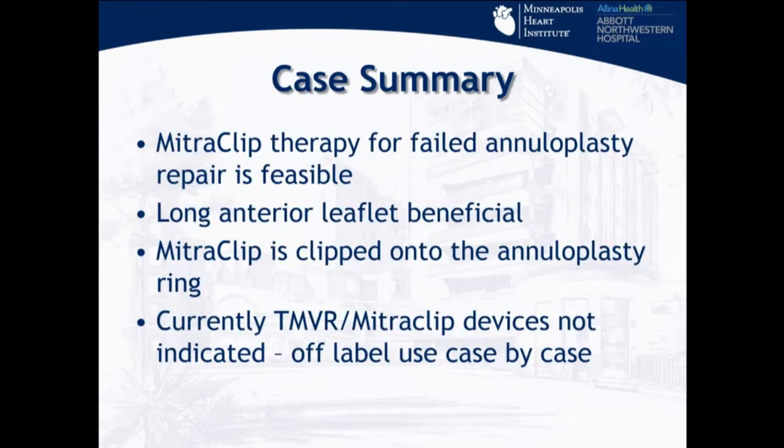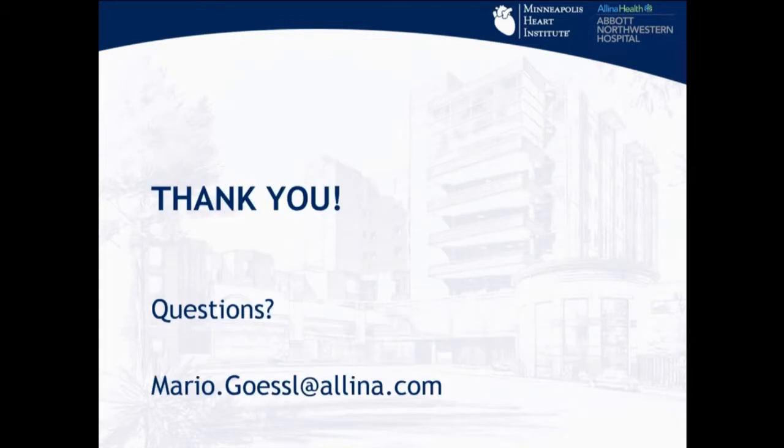So just as a summary, this is an off-label use of the MitraClip, but for failed annuloplasty, if you have a long anterior leaflet, I think it's an option at least to consider. Now that we have other annuloplasty devices, that definitely is another option. If you're very experienced surgeons, we have those, but that might not be an option overall. And other TMVR MitraClip devices might even improve for future therapeutic options here. Thank you.